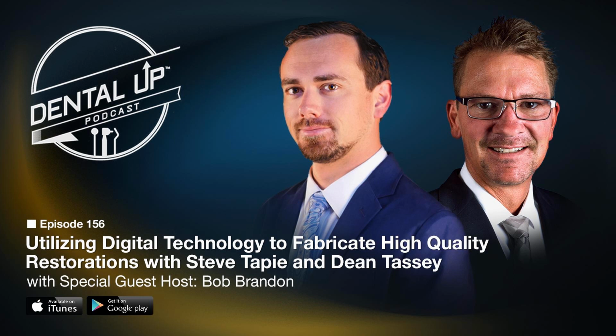It helps a lot, too, with showing doctors any concerns that we might have or for design approval, because they are connected through the 3Shape Communicate portal. So any design that we do, we can send back to them, and they can manipulate in three-dimensional space. It's not just a 2D screenshot that we would have to send to other doctors with other scanners.